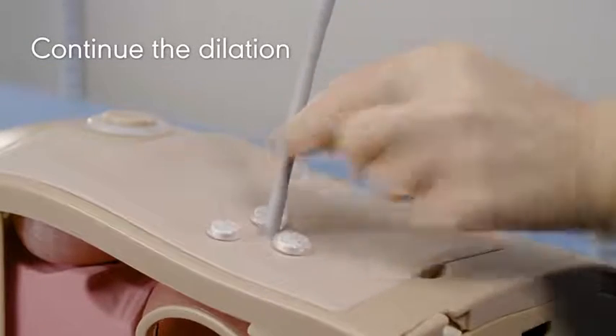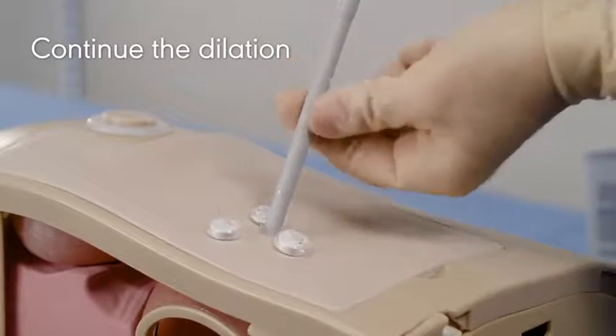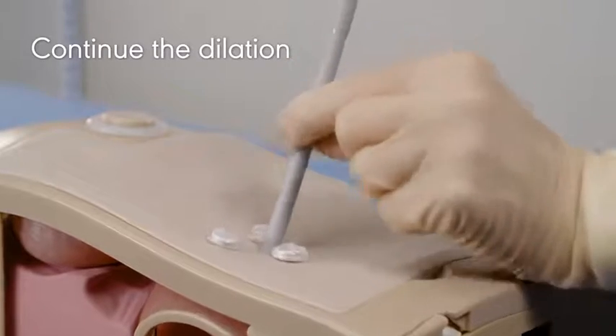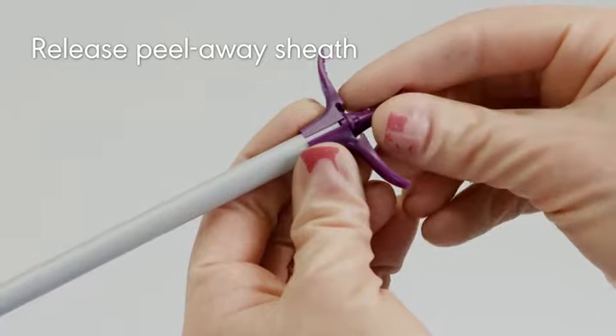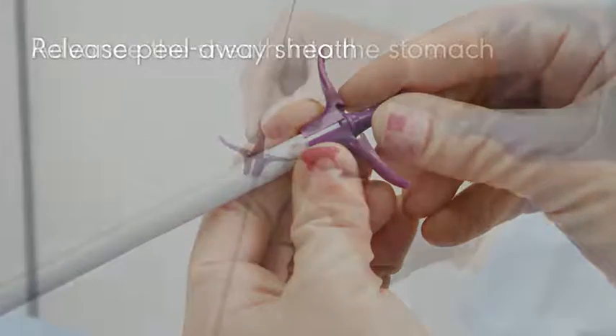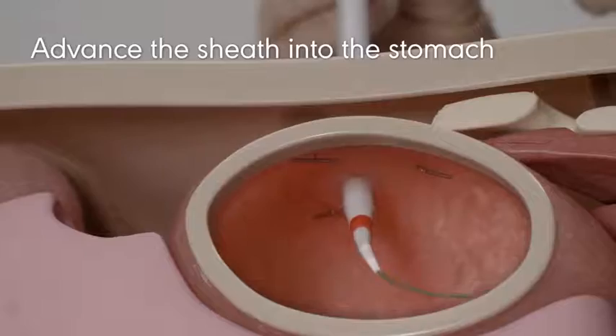Continue dilation until all dilator sleeves have been advanced. Twist the dilator hub to release the peel-away sheath from the dilator. Lubricate with water-soluble lubricant and advance the sheath through the tract and into the stomach.